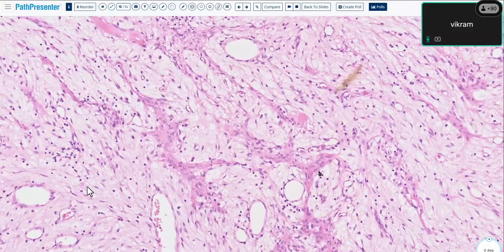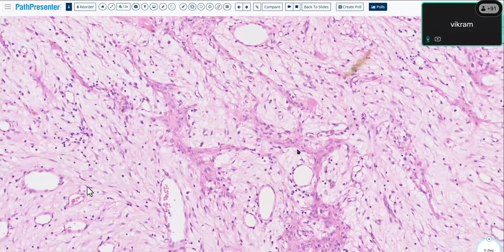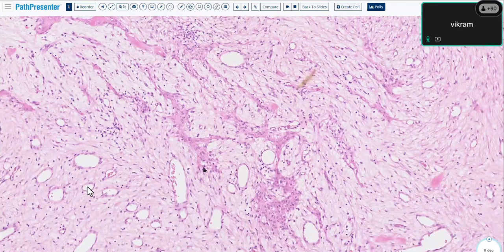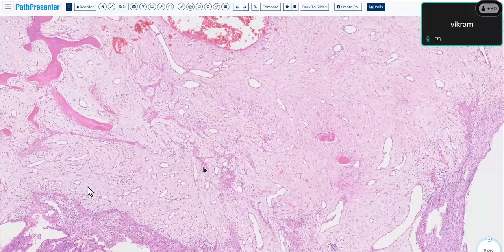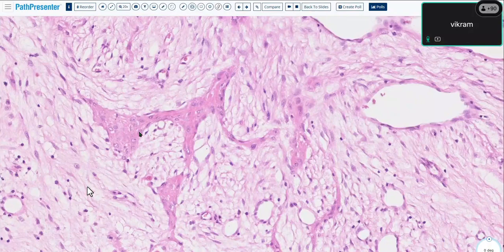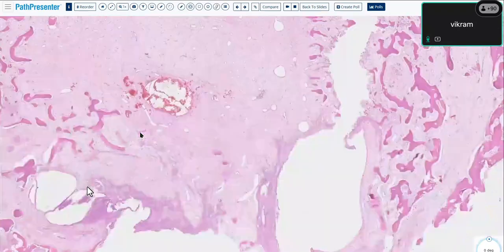The osteoblasts are not well developed, so these are more bone precursors, osteogenic precursor cells. Someone could look at this and call it osteosarcoma, but even in this, the most immature component, you see it has a slightly Roman arch-like configuration. It's just far more organized than an osteosarcoma. In osteosarcomas, the bone is distributed in a very random fashion. Here's more of that immature bone with these osteogenic precursor cells. But it's that low power zonation that is very, very typical.